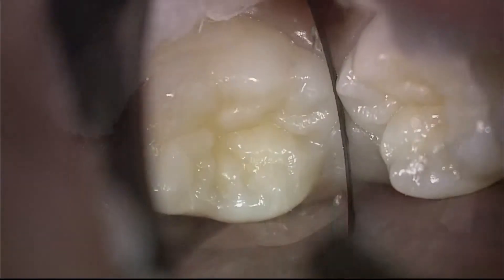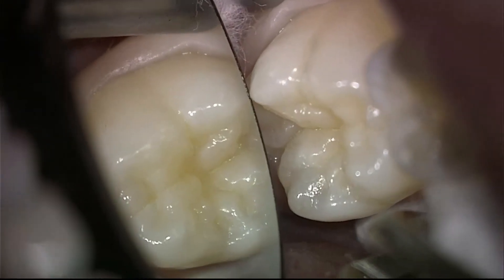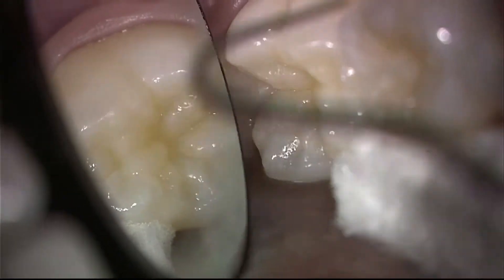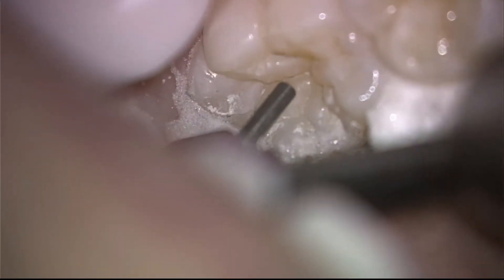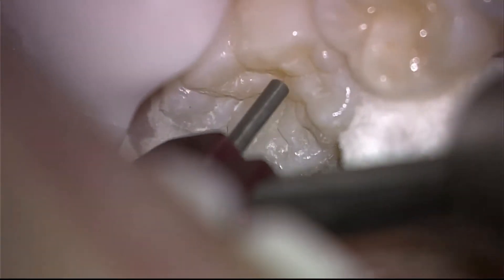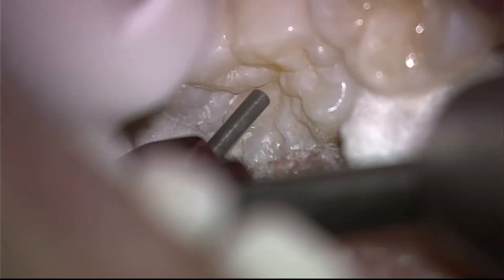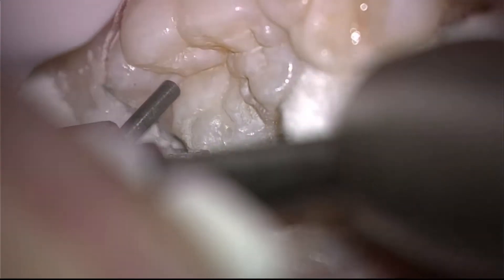So let's clean this off and use high magnification to verify that we do need a sealant. We'll use micro-air abrasion to clean out the grooves in this beautiful six-year-old molar. With the small nozzle and the accuracy of this instrument, we can verify there are no points of breakthrough into the internal part of the tooth. We want to make sure that nothing is left behind but tooth structure so that we can bond to it. Micro-air abrasion is the answer to this in super sealants.